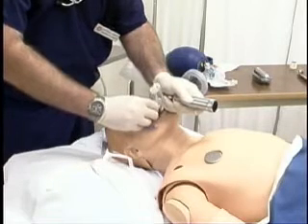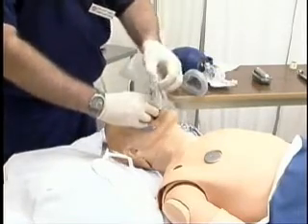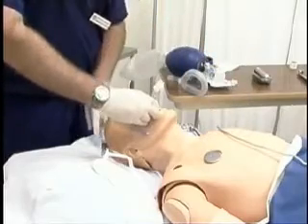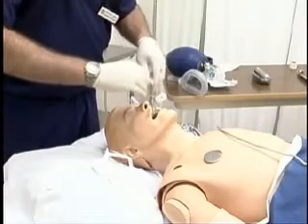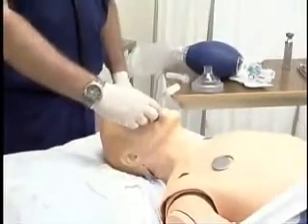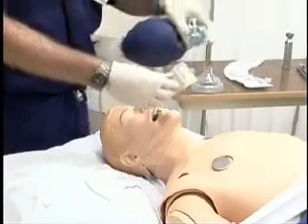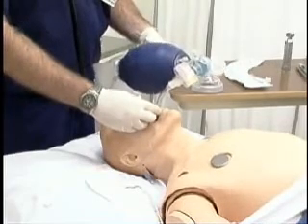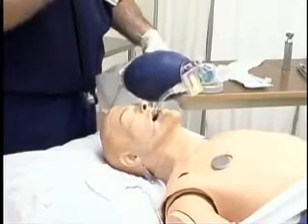I'm going to place the tube at about 24 centimeters at the lip — that's usually good for an adult. I'm going to pull the stylet out of the endotracheal tube at this time, keeping my fingers around the tube so as not to dislodge the airway. I'm going to take my syringe with the 10cc's and inflate the balloon. Now that we've intubated the patient, we're going to ventilate. I'm going to attach an end-tidal CO2 adapter to confirm placement of the endotracheal tube. I should see a change in this adapter to a color of yellow. I'm going to listen over the lungs and over the belly to confirm placement as well.